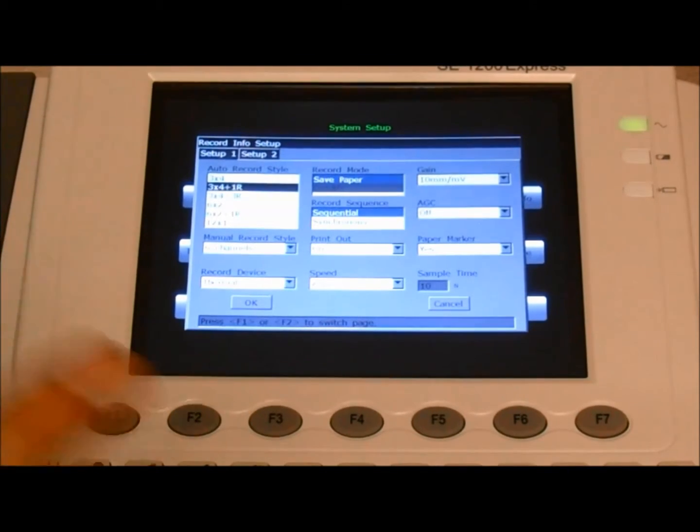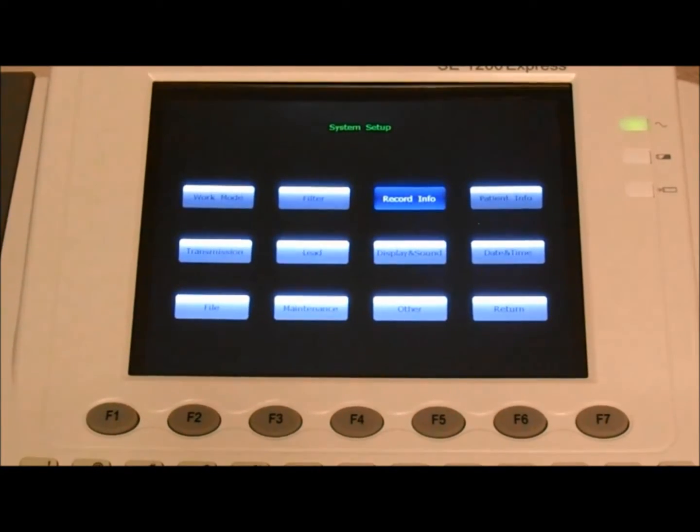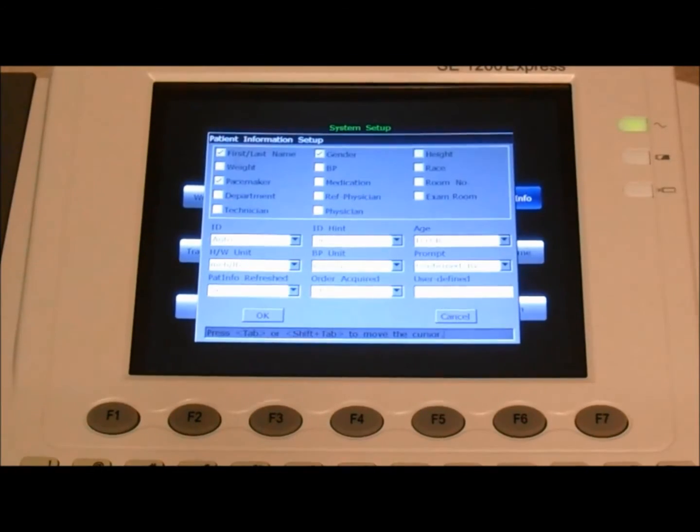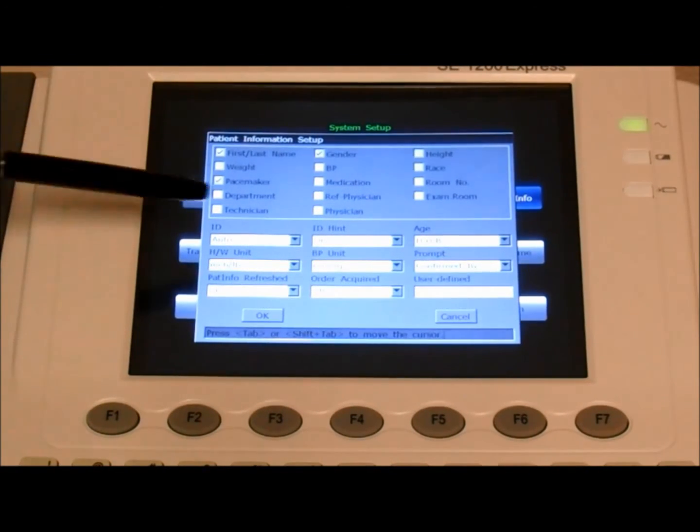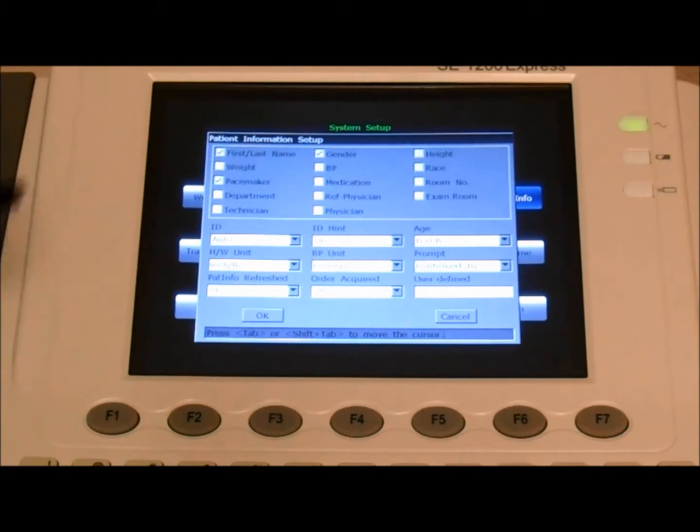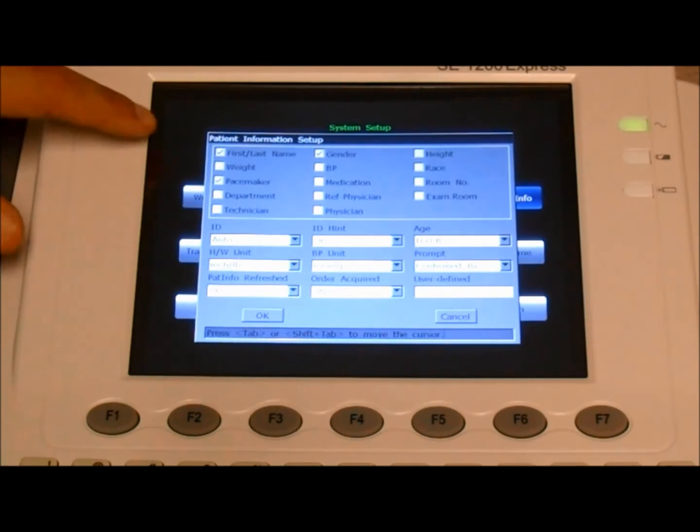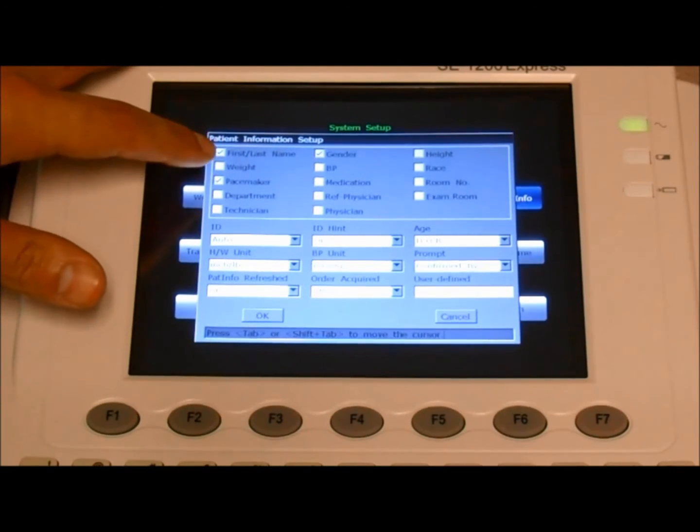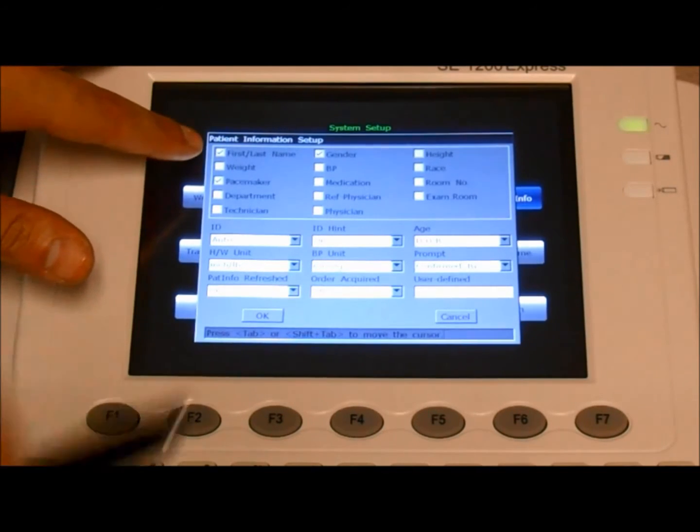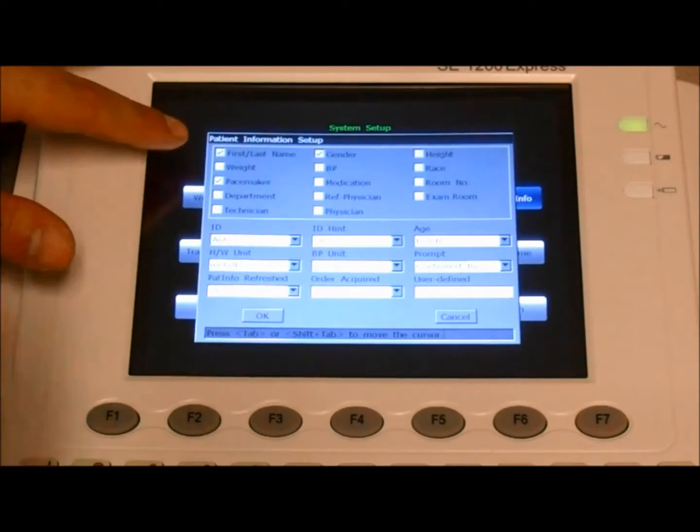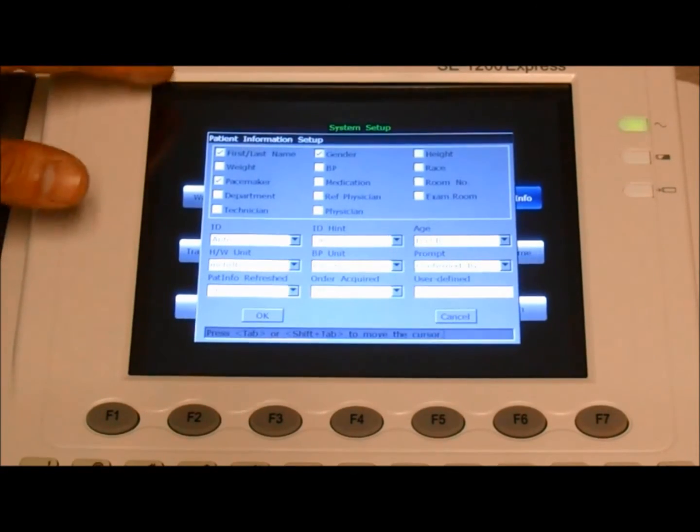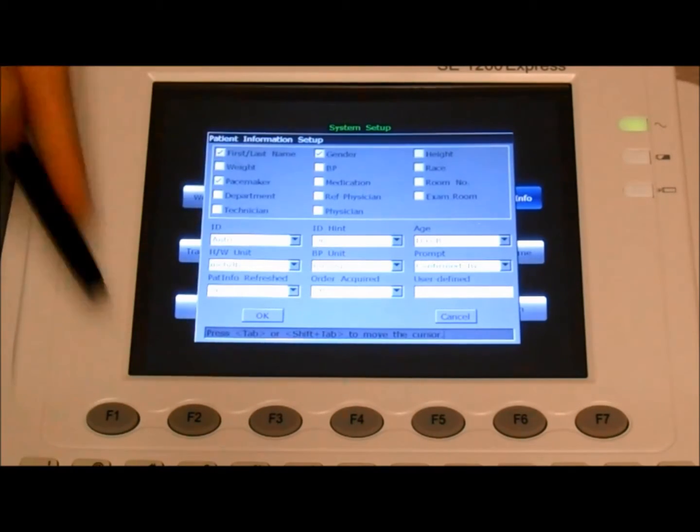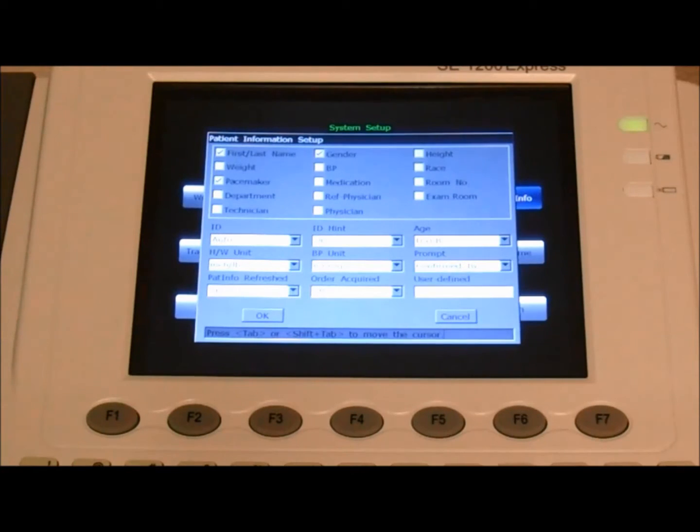So once we check those three settings, press enter, and finally enter patient info. So under the patient info setup, we can control what information input boxes are included when we enter the information. For example, we have first and last name checked. This means that the customer or the operator can enter the first and last name of the patient. And there's various different options that we can include or not include, depending on user preference.